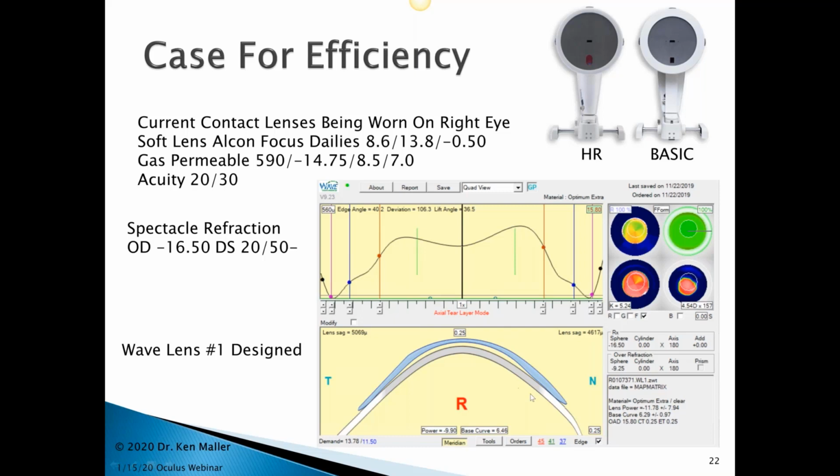But with the Pentacam data, we have all of the actual corneal and scleral data here, and we can actually go to town and really make a truly customized lens land on this particular eye, specifying everything and anything I want that's manufacturable by a lathe. You can also see on here, this particular graphic map over here is actually the front surface of this Wave lens, and you can see just how asymmetric all the power curves are going to be on this lens.